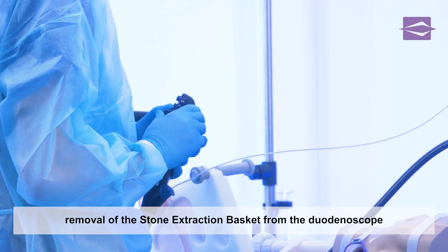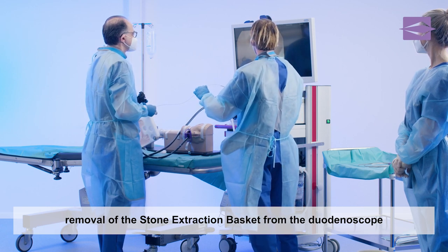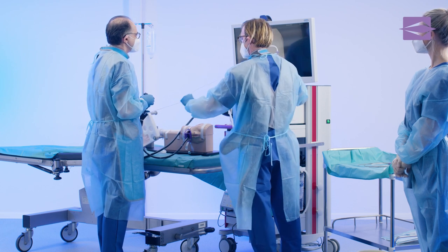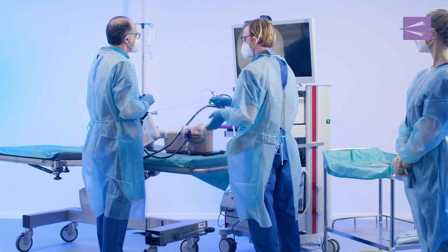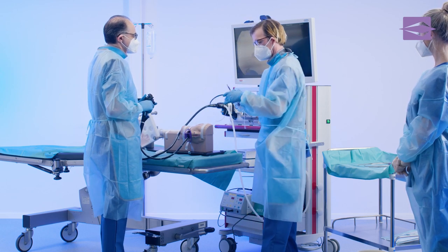The stone extraction ends with the careful removal of the stone extraction basket from the duodenoscope. You saw a demonstration on endoscopic retrograde cholangiopancreatography, discipline: stone extraction using a stone extraction basket.